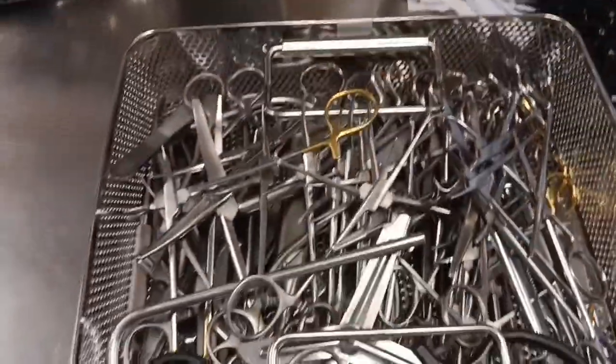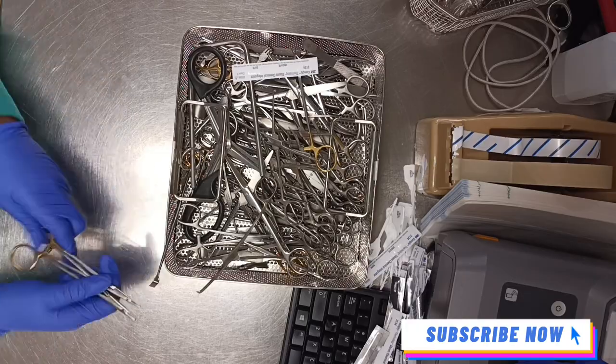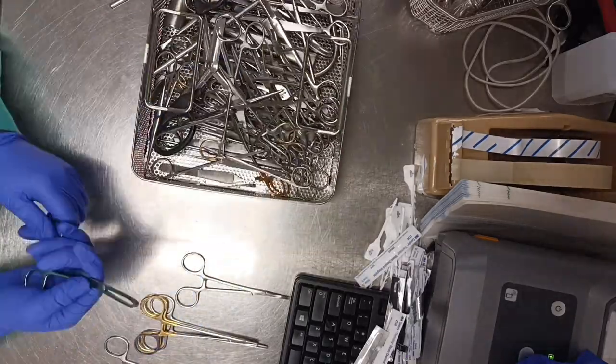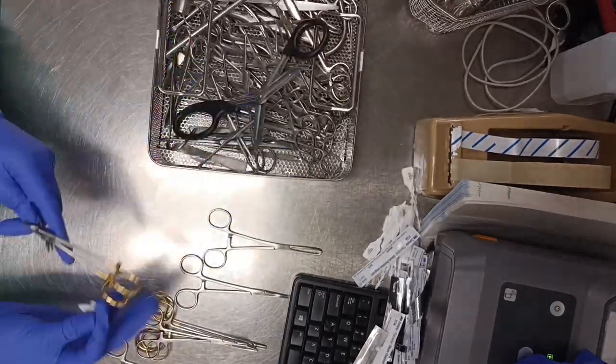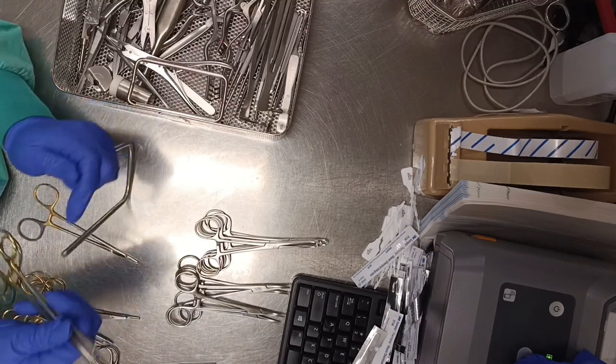Today I'm going to be showing you how to assemble a set, and the set for today is going to be the minor set. I'm going to start out by putting in my indicators in the set, and the next thing I'm going to do is inspect the instruments to make sure all of them are clean and free of all debris and all the bad stuff. So right now I'm just going to go ahead and put them on the stringer.